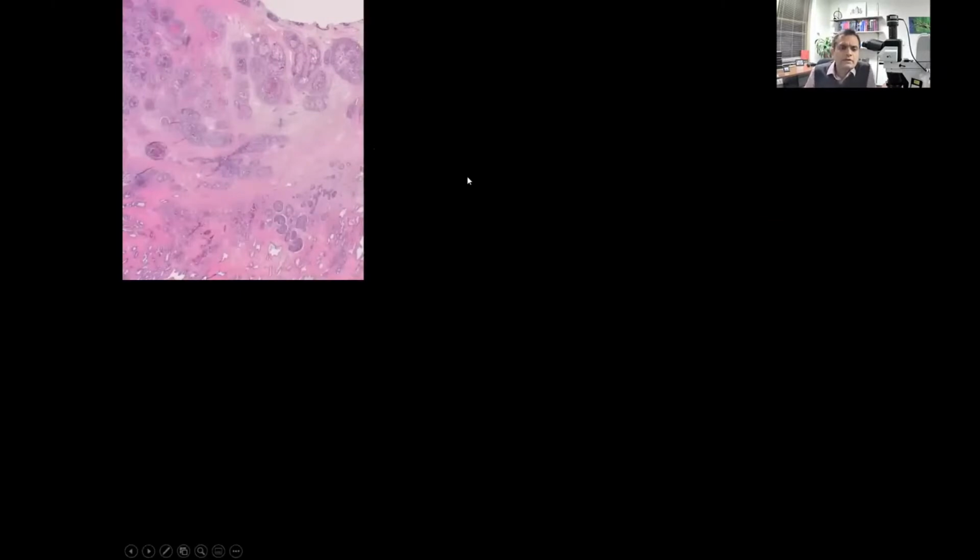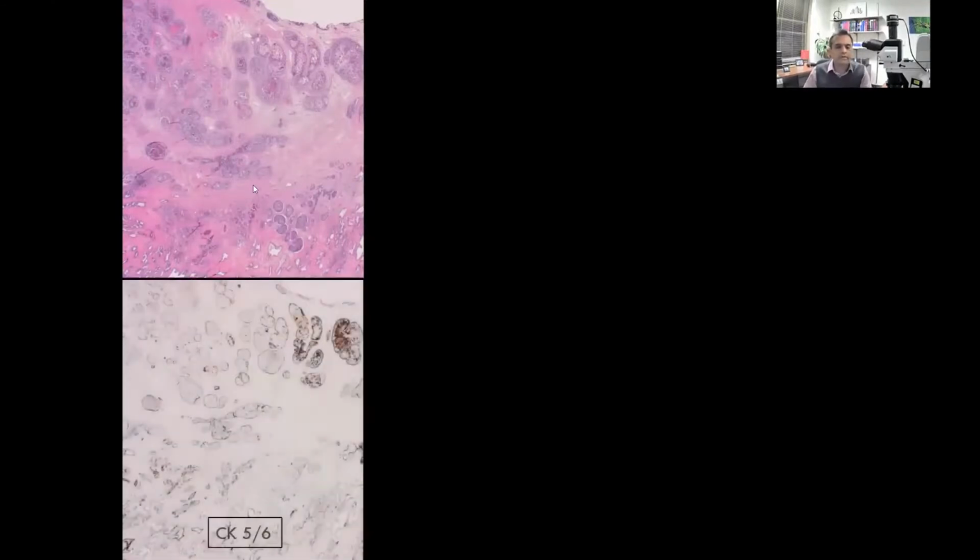This is a urothelial carcinoma in the prostate, and you can see how extensively it's involving all the prostatic glands right here, and it's also involving the prostatic acini here. And believe it or not, all this is just in situ carcinoma. One, because most of it is rounded, it's involving the ducts.